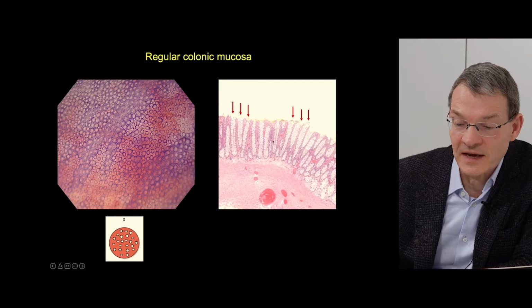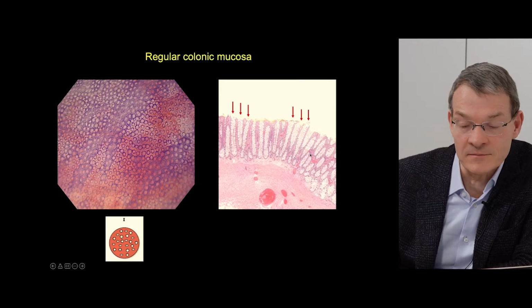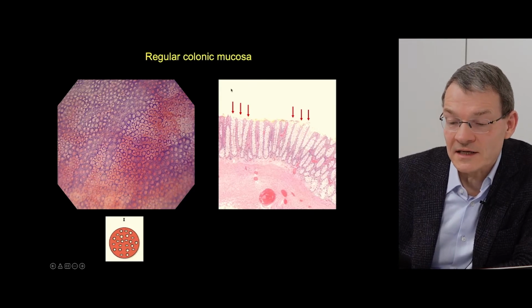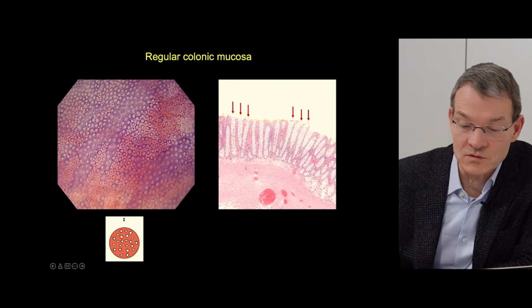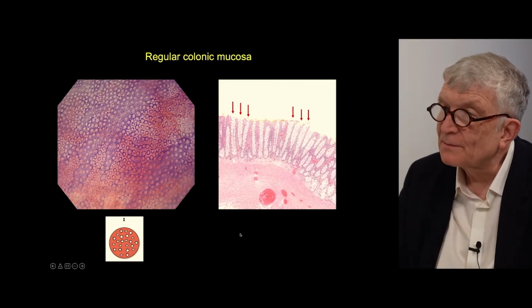And this is the same patient. Here you see the histopathology, and you can nicely appreciate this regular opening of the colonic mucosa. So this is Kudo 1. It's regular mucosa, little bubbles, yes.